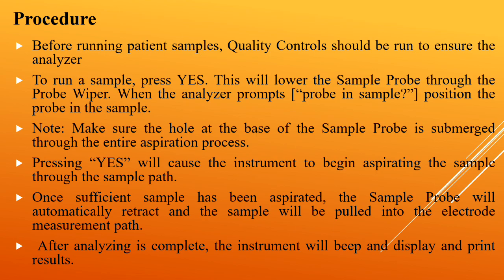After pressing probe in sample, we have to keep the sample, and when the analyzer is taking the sample from the probe, we have to ensure that it is dipped or submerged through the entire aspiration process.